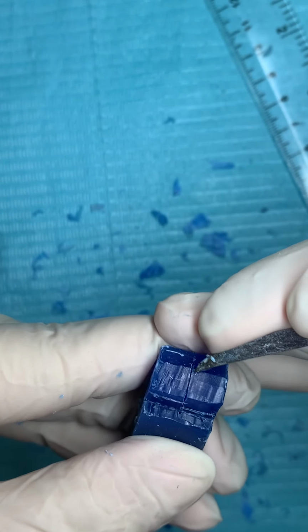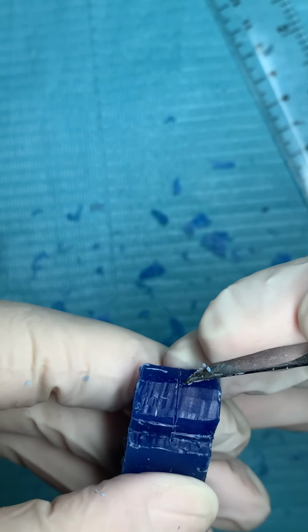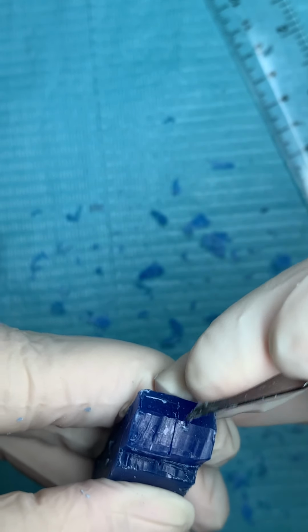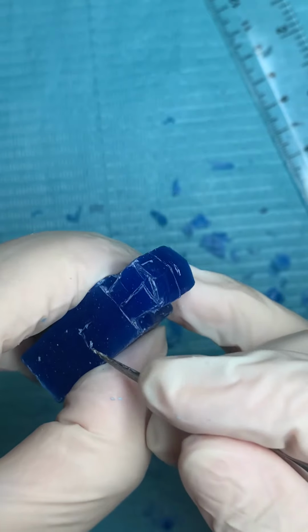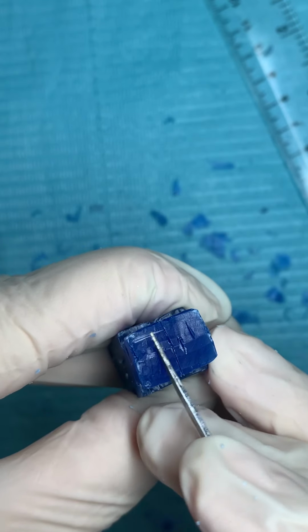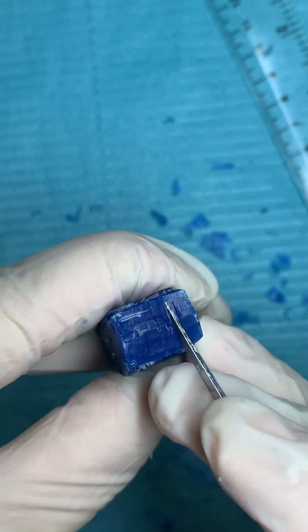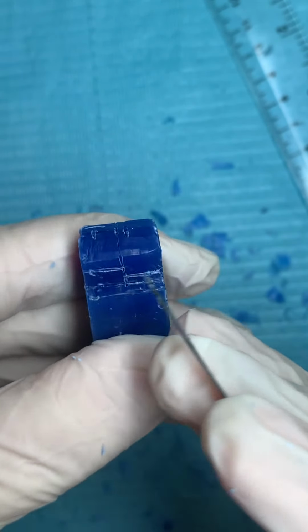So stand here. This is the buccal side. Measure from this part 1.5 millimeter. Okay. And toward the lingual side, I will measure more. It will be 4 millimeter. Plus 1.5 here from the midline toward the buccal, toward the lingual maybe 4 millimeter. Okay, so this will be my buccal cusp tip, this will be my lingual cusp tip, this is my buccal side. Okay, so the crown will be lingually inclined.